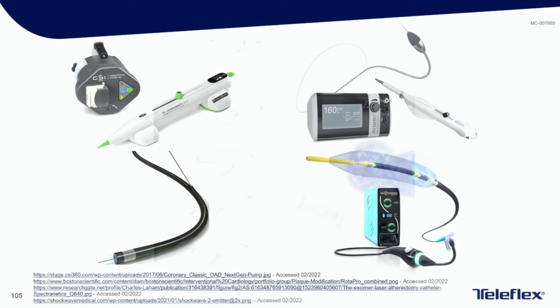So calcium modification, the last topic we'll talk about tonight. You can't talk about complex coronary disease without figuring out how we deal with these calcified patients. One of the things that we look at in JCTO and risk calculations for these patients as well. Historically, orbital and rotational atherectomy have been the mainstays of treatment. Laser atherectomy before that, but really laser is limited to mild or even moderate calcification. The CSI device proved to be easier to use until the advent of the newer version of the rotablator from Boston Scientific, which is also now used frequently by many institutions.